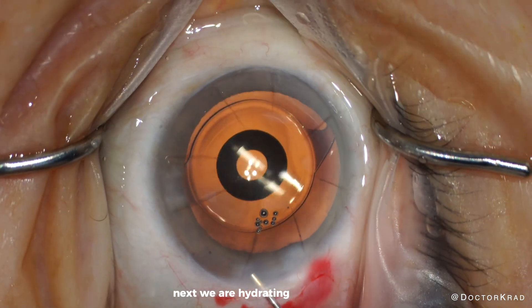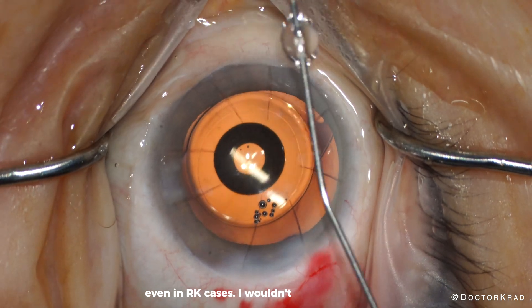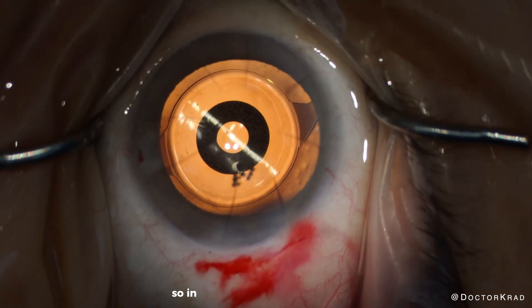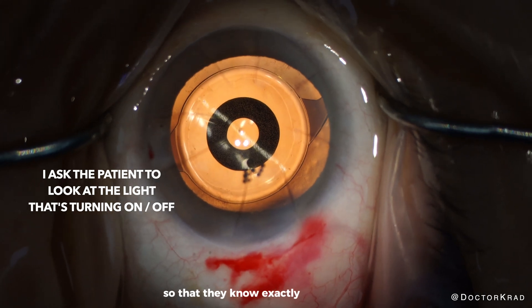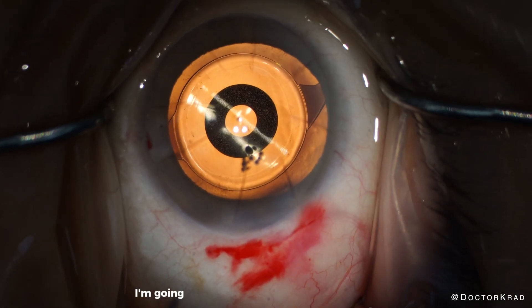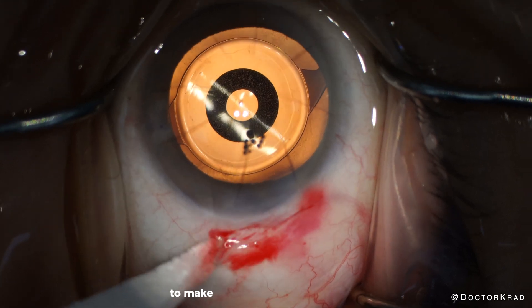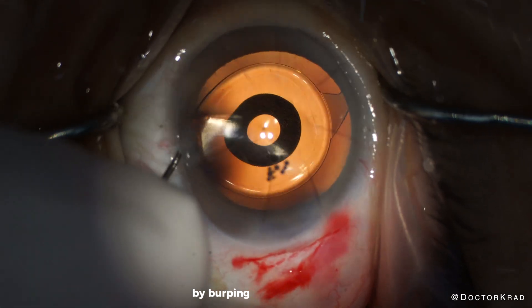Next we are hydrating the incisions, making sure they are watertight. I rarely ever need a suture for my temporal incision, even in RK cases — when the incision is created properly, you just don't need it. I notice the patient is roaming their eye around and not fixating at the lights, so I take one of the lights and turn it off and then turn it on, making it blink so that they know exactly which light I want them to look at. That helps me center the lens implant perfectly. Next I instill some antibiotics inside the eye, confirm the eye pressure is appropriate, stress test the main incision, and adjust eye pressure by burping the paracentesis as needed.